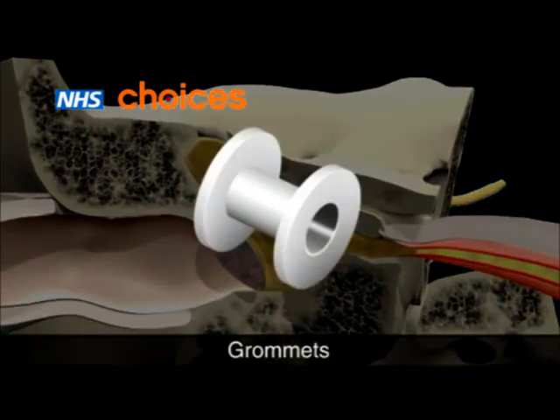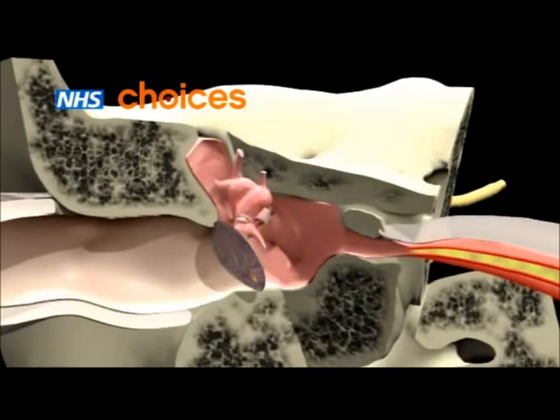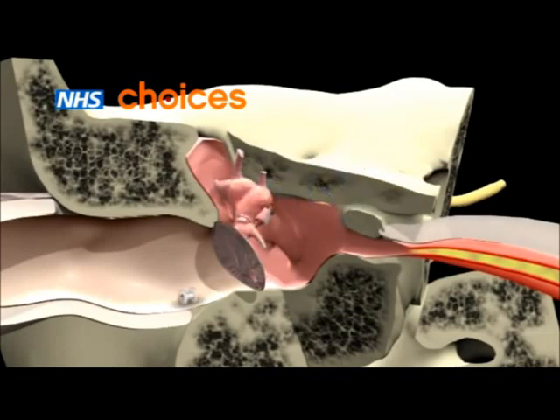Grommets are not a cure for glue ear, but help to bring air back into the middle ear, which improves hearing. The surgeon will start by making a small hole in the eardrum and draining away the fluid. The grommet is then placed in the hole, which allows air to move in and out of the middle ear, and the ossicles to move freely, thereby restoring hearing. Grommets usually fall out after 9 to 15 months, and around 30% of children who have had grommets inserted will need them replaced.